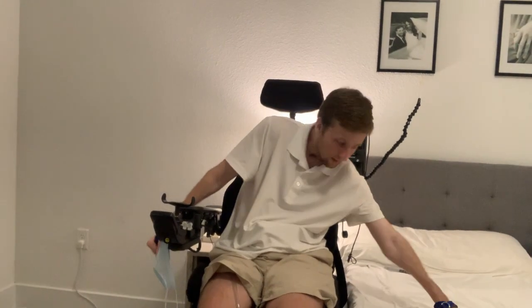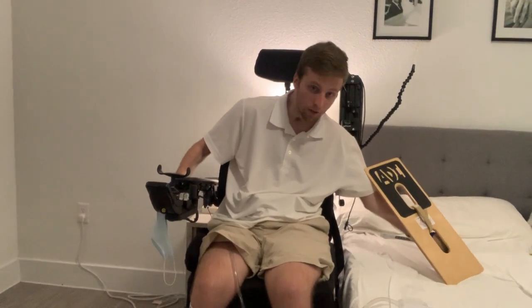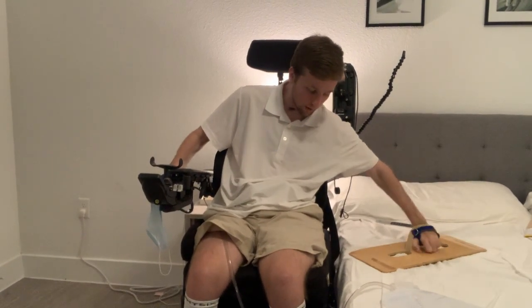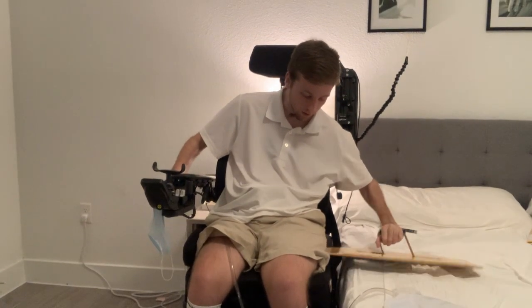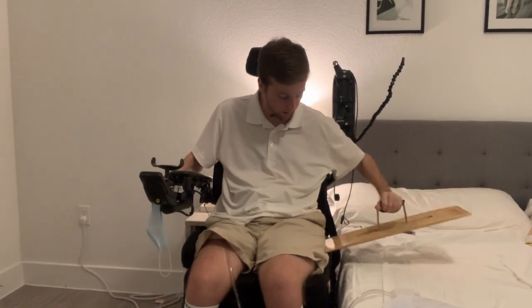I use ADI sliding boards — they have a grip on the bottom similar to what they use on skateboards, which really helps it stick under your butt. I like to place that side under my butt when I start, and then I just wiggle it in.